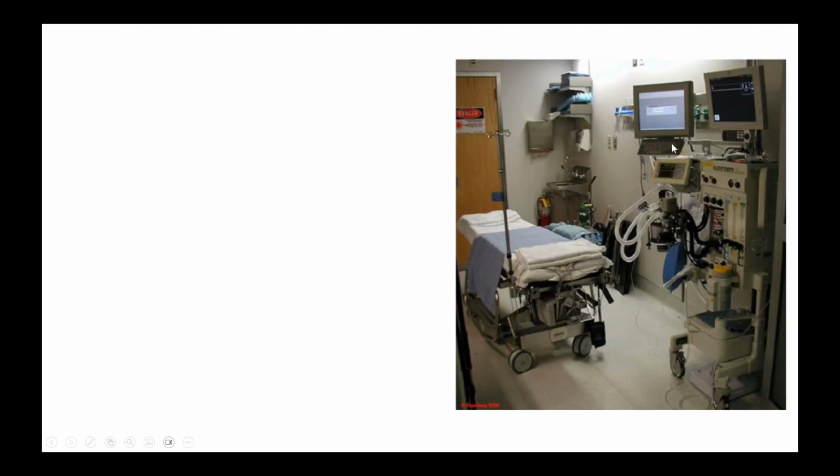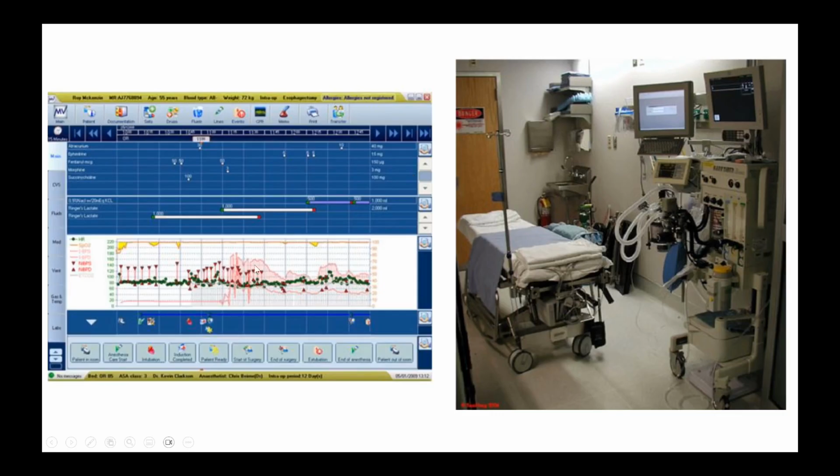What was the patient's starting BP, what is the end BP, what was the patient's temperature before starting, what is the ambient room temperature, whether the patient went into hypothermia, whether you used a warmer, all these things can be completely given. So you get the entire information in this small piece of equipment, and that will help. This is the way the recording is done.